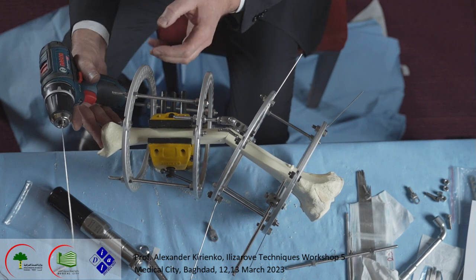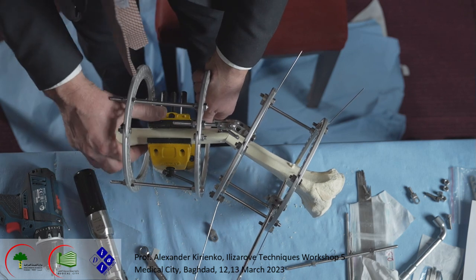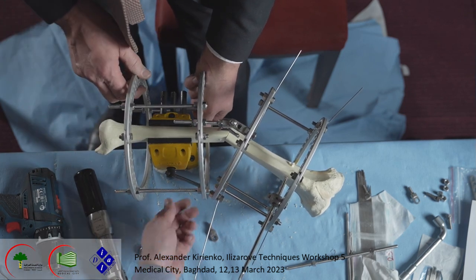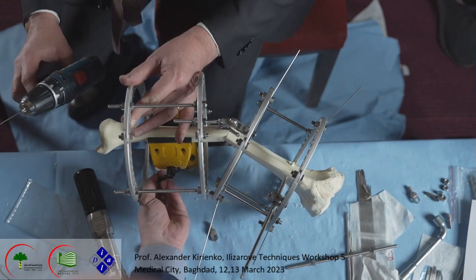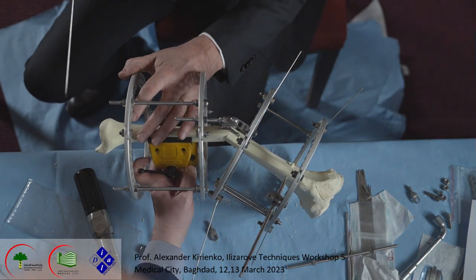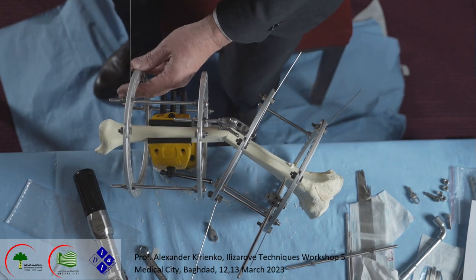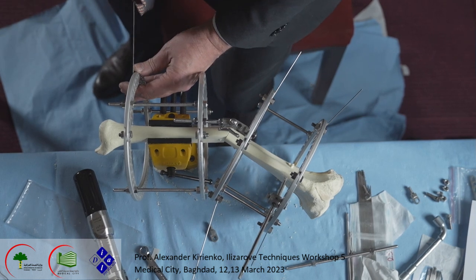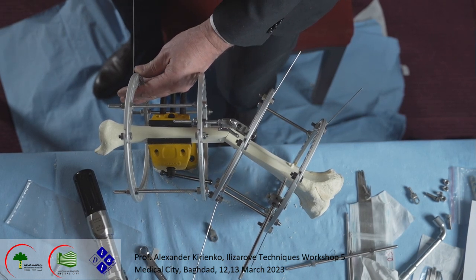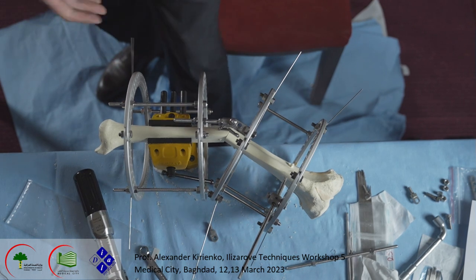What we do now, we see the bone. Okay, and this way I put a simple wire perpendicular to the axis of the distal tibia, like this. Okay, to bolt.